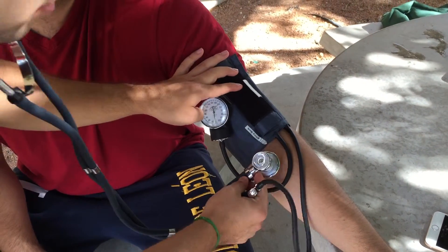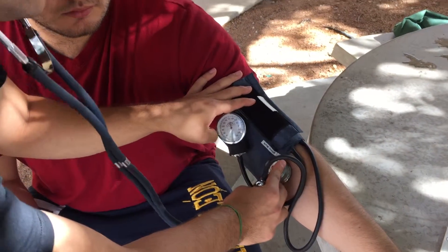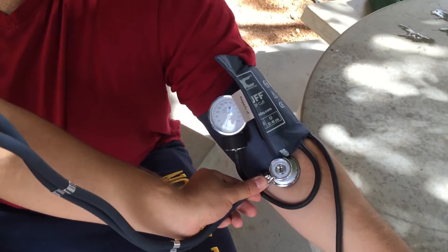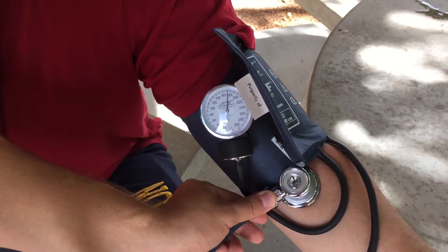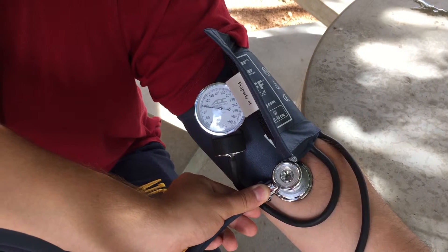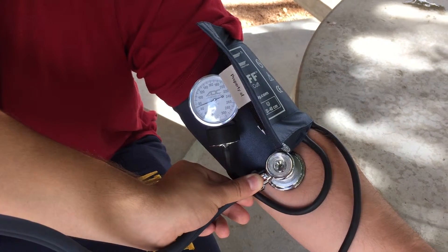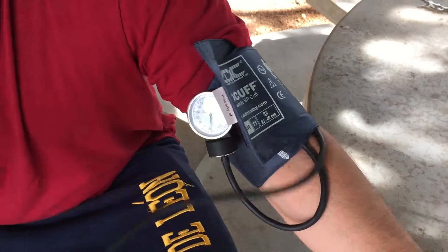I'm going to insert the stethoscope right here, right up against his brachial artery. It's very important that you line up the stethoscope with the brachial artery. Be sure to inflate the pump to about 180 millimeters of mercury. Once you inflate to 180 millimeters of mercury, you are going to want to release at two millimeters of mercury per second.